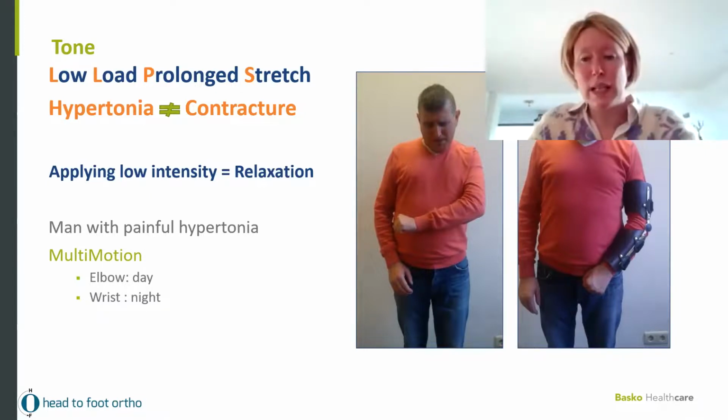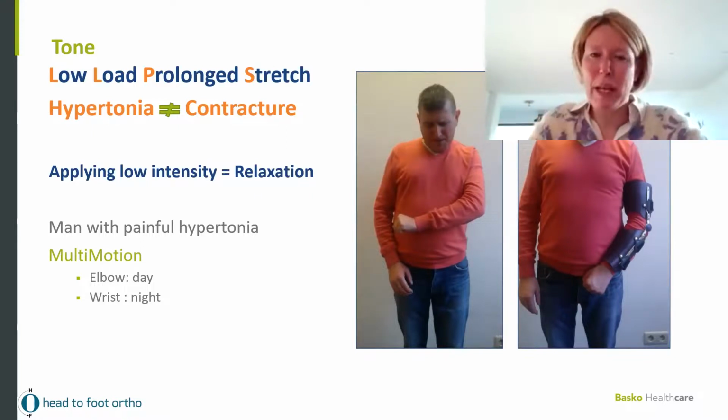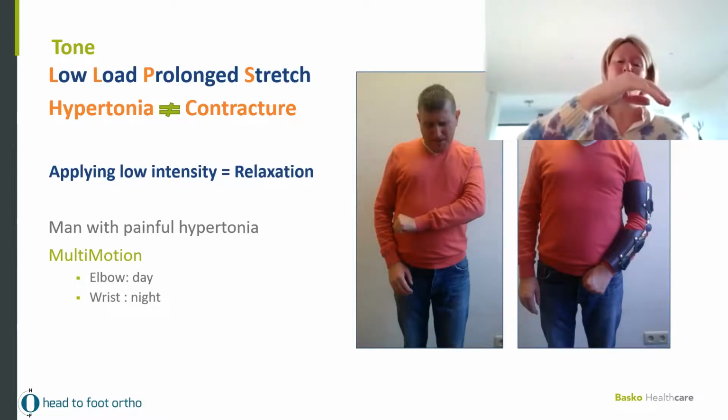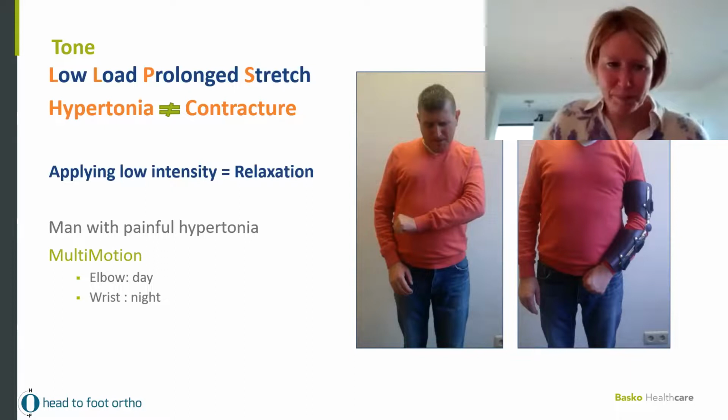Good to know is that this patient uses multimotion during the day on his elbow because he says it helps me to do some activities. And during the night, he is wearing multimotion on his wrist to have an opening with his fingers in the functional position. And we work on the wrist. So you have a beautiful opening for that.